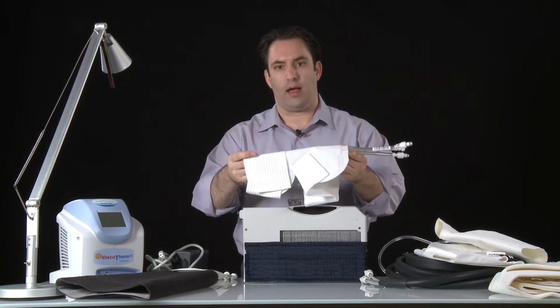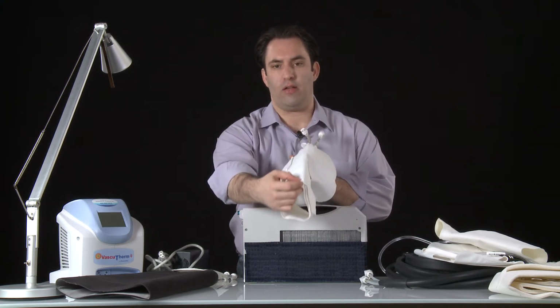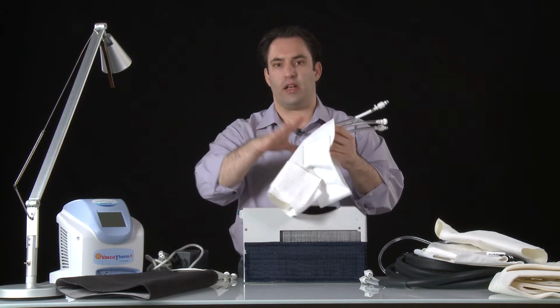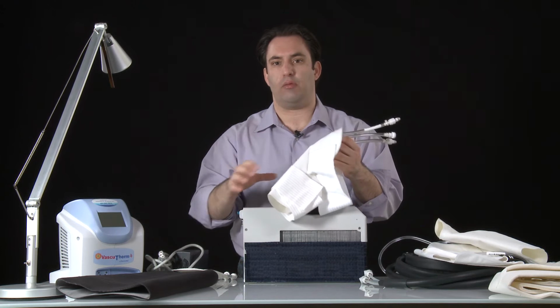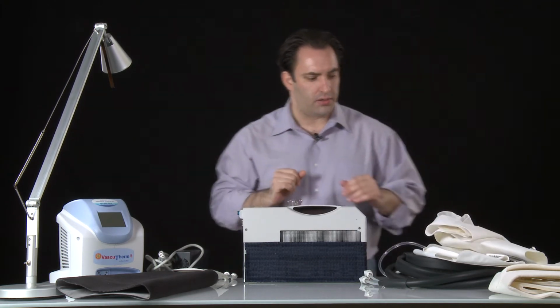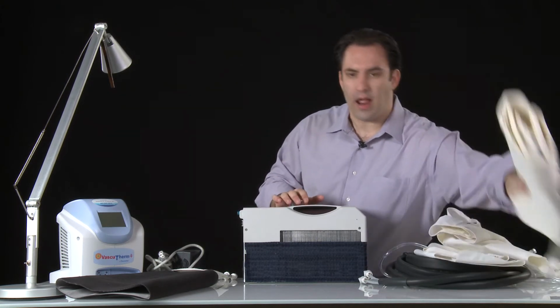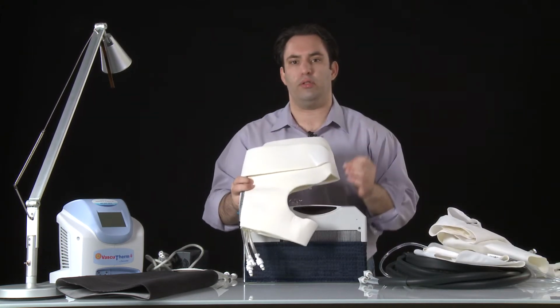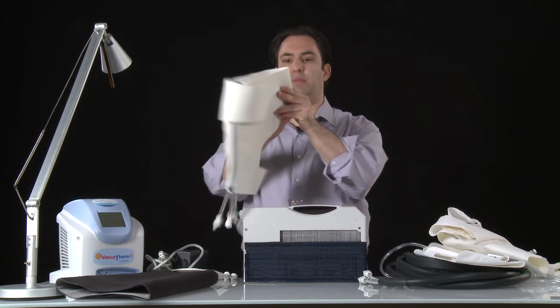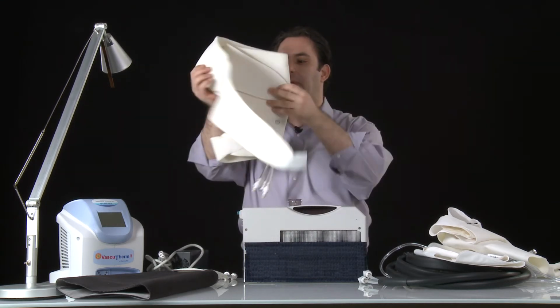Basically, we're going to put this on the ankle, the foot, the knee, etc., and we've got a couple of lines that come out of it. It's going to compress, and it's going to run either heat or cold through, and temperature regulated for determined periods of time. And that's going to act as local compression and local temperature for pain management. Now, this is wrapped together, but it's pretty self-explanatory.